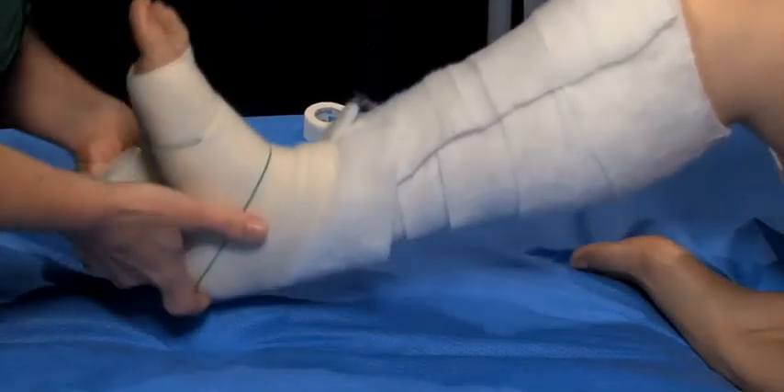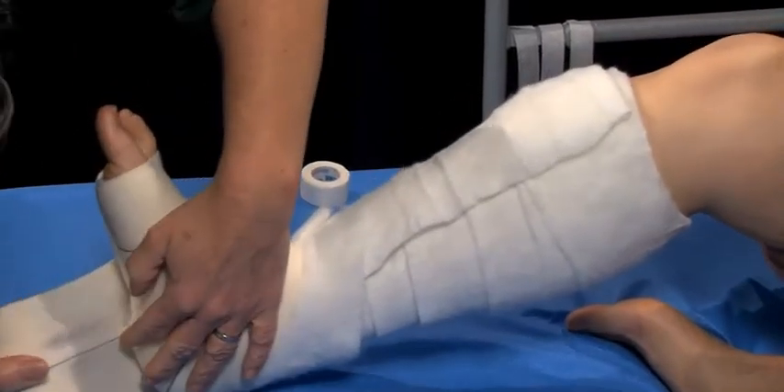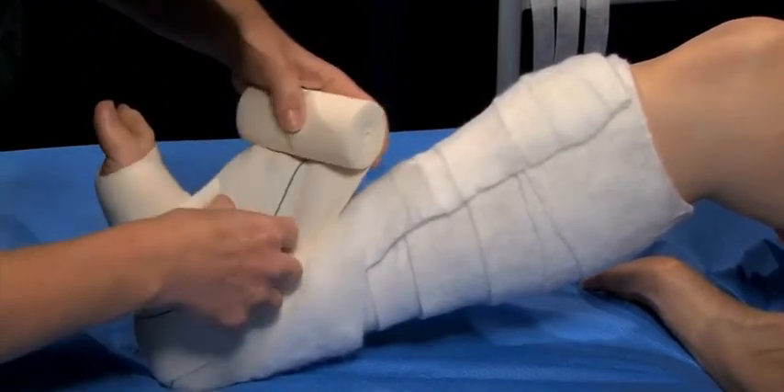Apply one to two anchor turns from the base of the toes. Cover the heel, followed by a turn under the heel, and finally around the Achilles tendon.